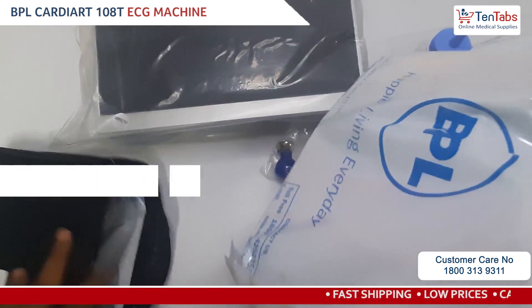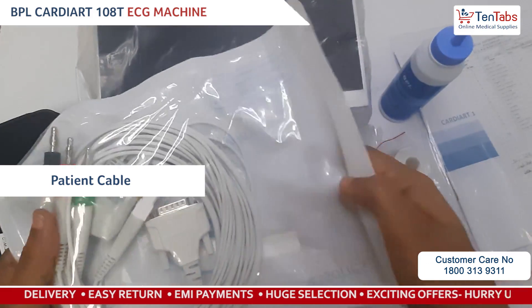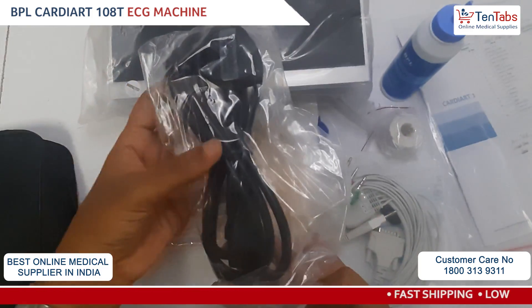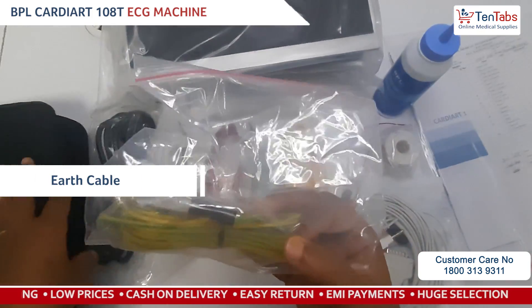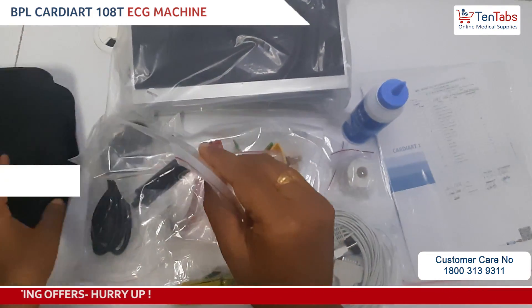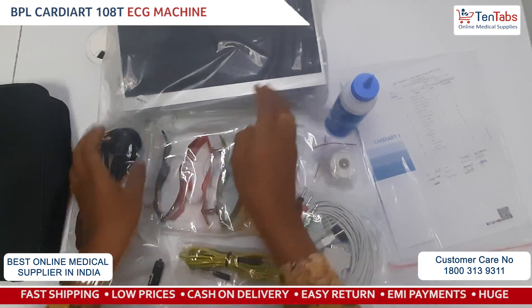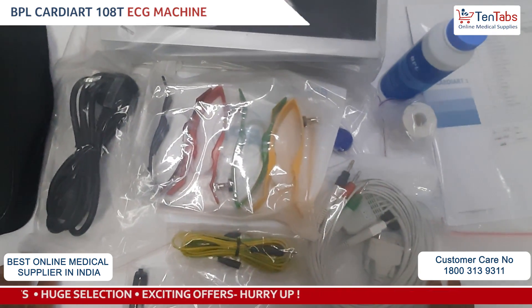Clamp electrode, patient cable, power cord, earthing wire, and ECG paper holder. So all of this is in the box of BPL Cardiart.